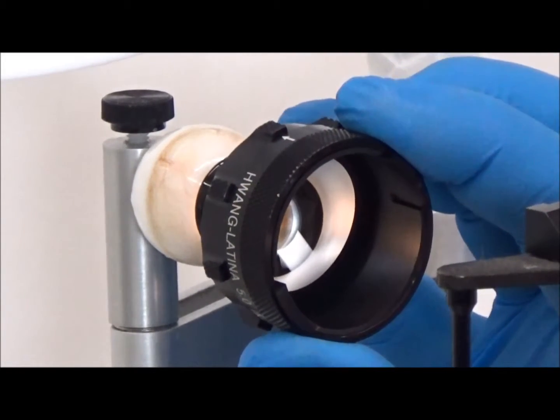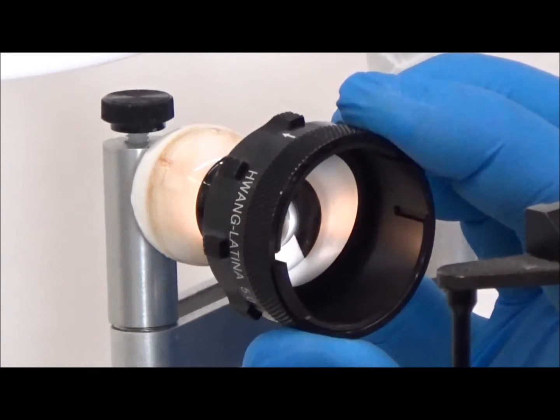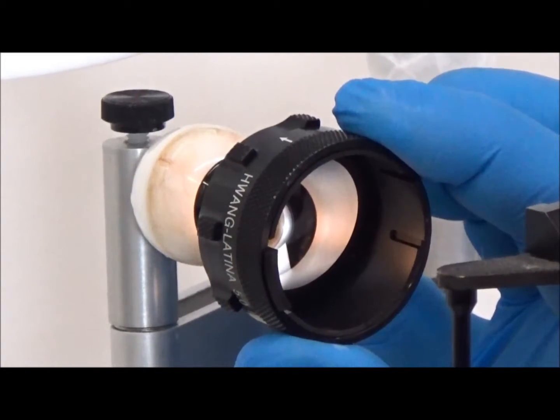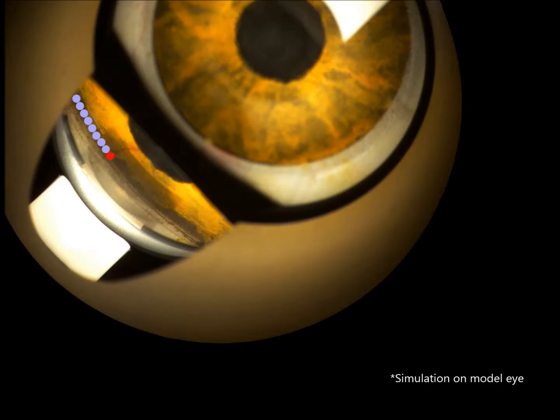Once the lens is rotated past the magnetic engagement, the rotation is free and smooth until the next indexing position is reached. This demonstration shows the reference figure being used as a guide for placement of sub-threshold laser spots. Precise 45-degree angular rotation of the contact lens ensures consecutive alignment of each series of laser spots.